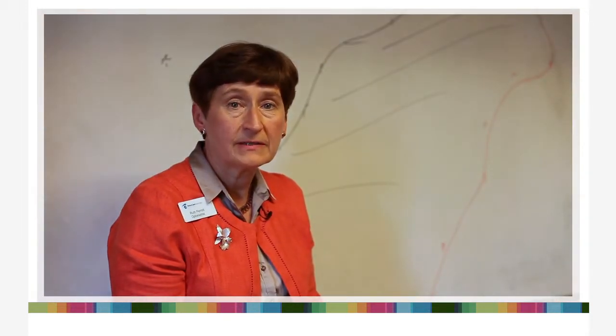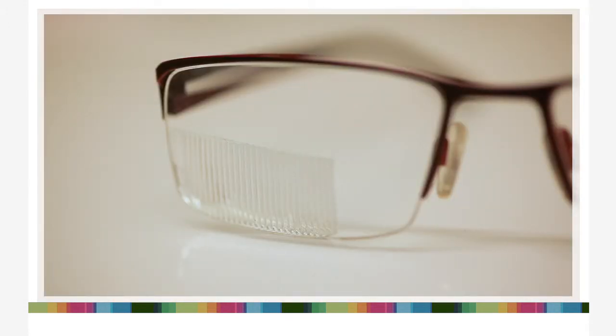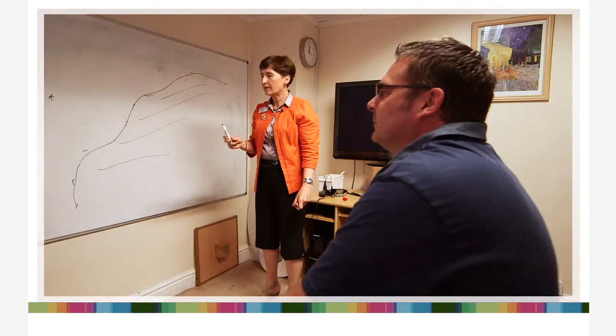He'd been searching on the internet for quite some time before he found me, but I'd been to some conferences in America and learnt that we could move space using prisms. And so when Ian arrived, we tested his eyes. He hadn't previously needed glasses, but we prescribed some glasses, and onto the lens we stuck a prism.